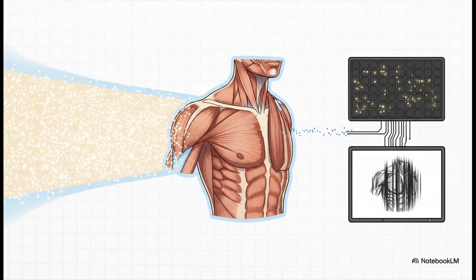So few X-ray photons actually make it all the way to the detector that the signal becomes incredibly weak and noisy. It's like trying to take a photo in a pitch-black room. The reconstruction algorithm then takes that tiny bit of noisy data and amplifies it, painting it back into the image as these huge, ugly streaks.